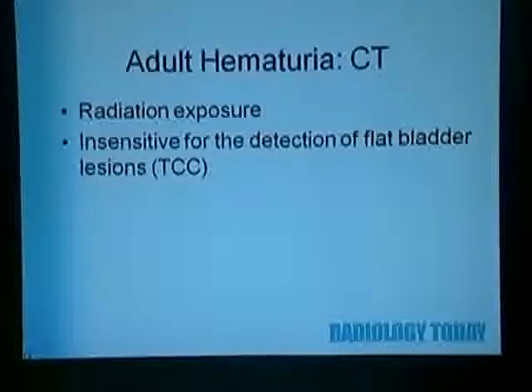The downside of CT is it involves radiation exposure, and it's also insensitive for the detection of flat bladder lesions. You can see how somebody could miss those. But in general, for a full workup of hematuria, we do this in conjunction with cystoscopy, as well as performed by urology, as well as urine cytology.